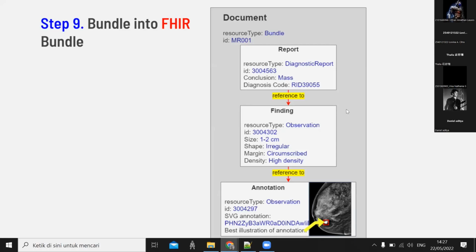In this example, the ID is generated by sequence. So in the FHIR server, it will start from, for example, 001 and then 002. It will have a sequence. But if we want to define the ID by ourselves, actually, we can also do that. Like we want to use a City Hospital TCH and then 001.